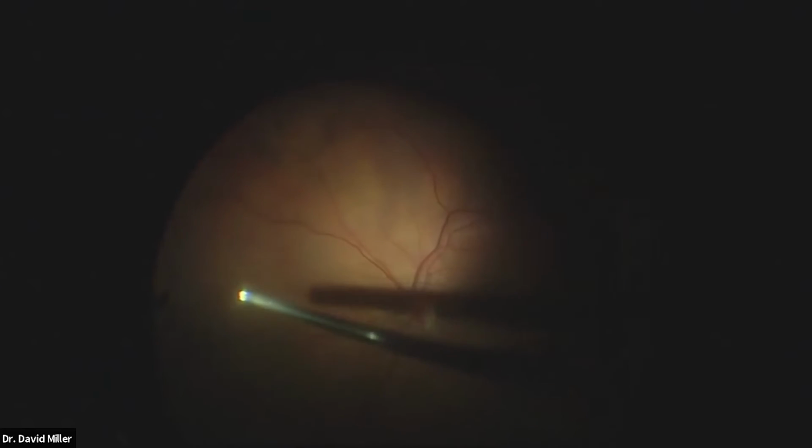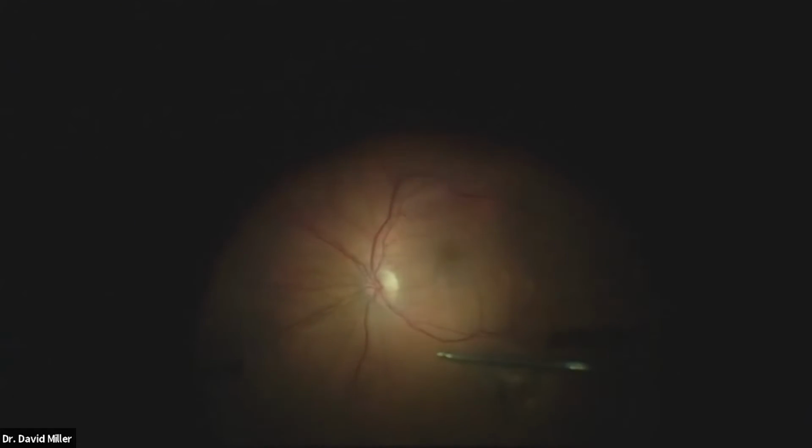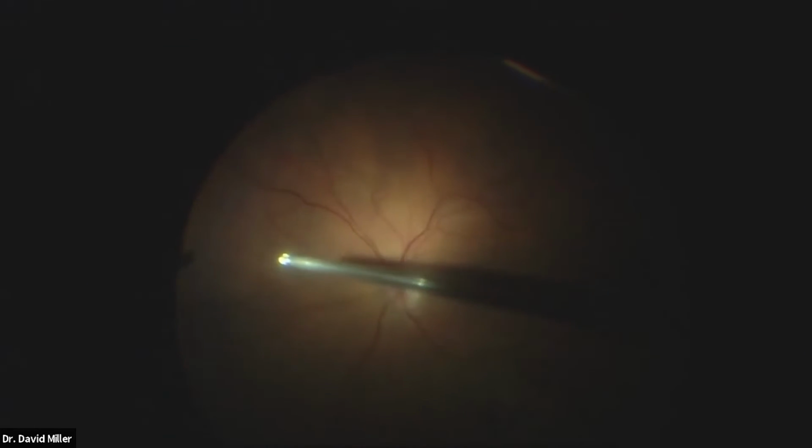Where's the detachment? It's running right down here at the bottom. You can see some laser scarring prior up top. And we know the detachment appeared about 1 month out, which tells us there may be a break somewhere at the horizontal or just below the horizontal.